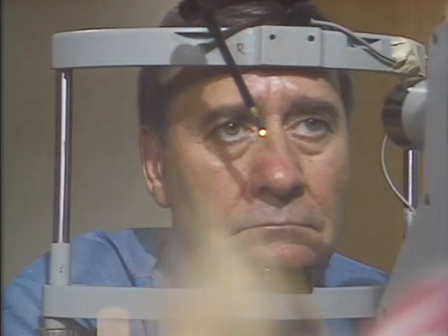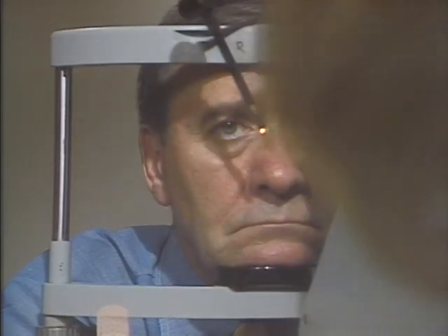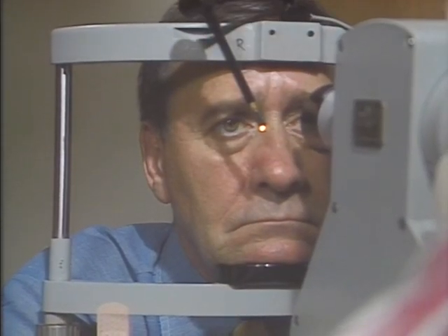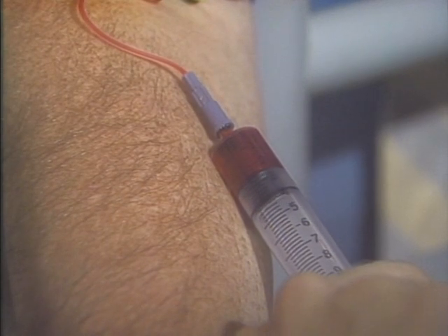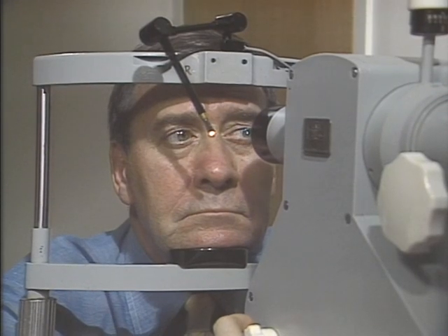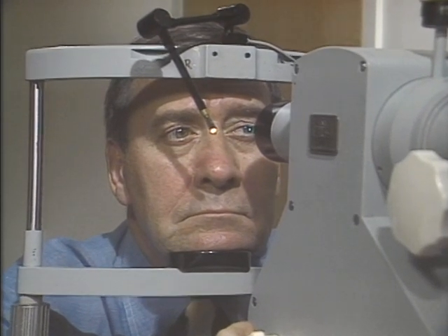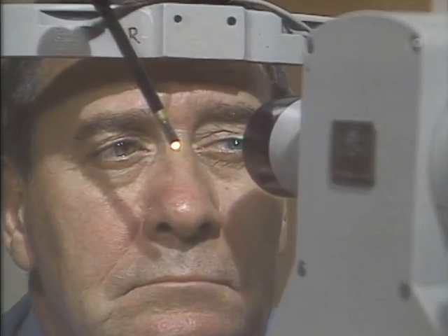We're ready to take the photographs now. I'd like you to rest your chin on the chin rest and tilt your forehead to touch the bar. I'd like you to watch this small target light in front of your right eye. I want you to keep your eyes open at all times. You can blink when you need to, but open wide and look right back at the target. Inject. Let me know if you have any burning or stinging. While the flash is bright, remember to blink quickly when you must, and keep your eyes wide open as much as you can.